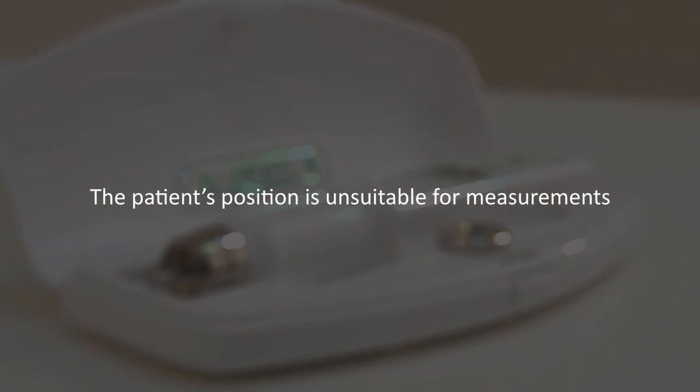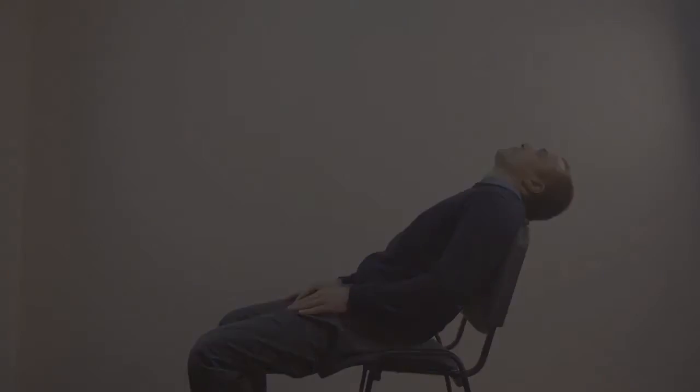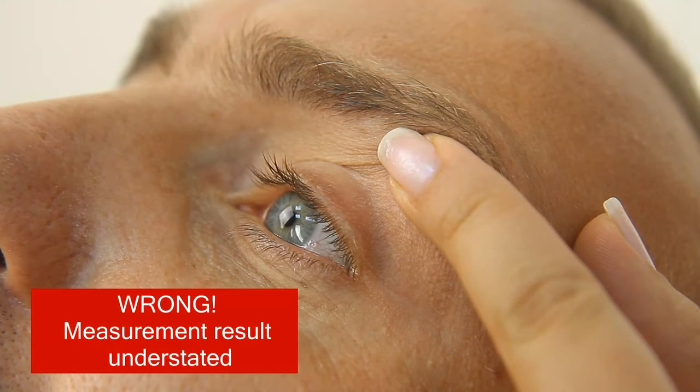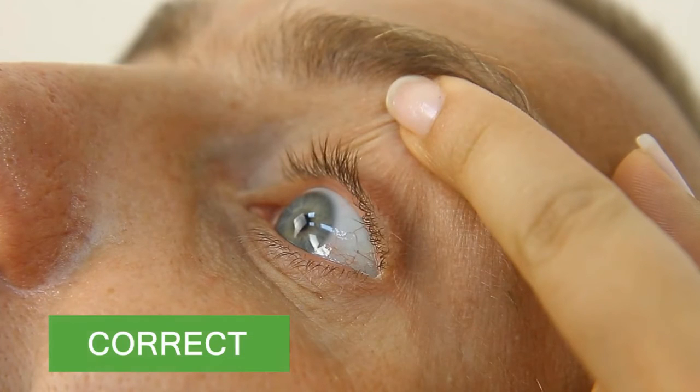Possible mistakes. The patient's position is unsuitable for measurements. The result will be inaccurate if the patient's posture is incorrect. For precise measuring results, the patient's head must be tilted back parallel to the floor. The eyelid is stretched incorrectly: the eyelid edge is below the limbus and touches the cornea, or the eyelid edge is too high above the limbus. For precise measurements, the eyelid edge must be one millimeter apart from the limbus.